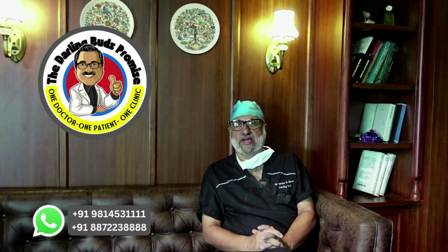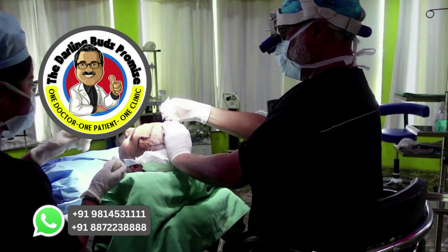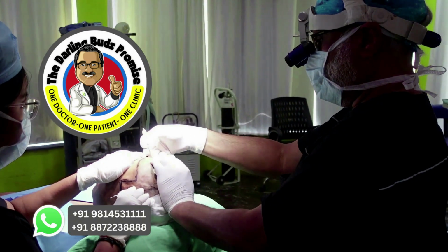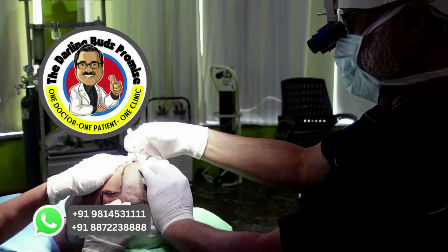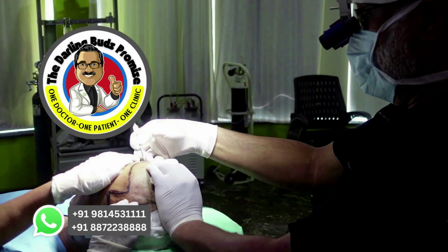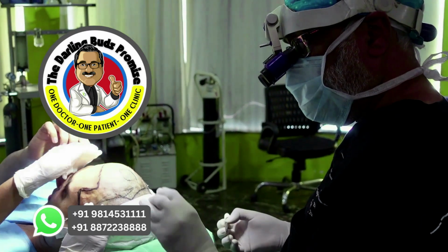And then I proceed to make the slits using the sapphire blade. The sapphire blade helps in minimizing slit trauma and better results, less telltale signs of surgery, decreasing the chances of a pluggy look, cobblestoning along the hairline, which can occur even with the best of technique in those patients who are prone to develop hypertrophic scarring and even keloid formation.